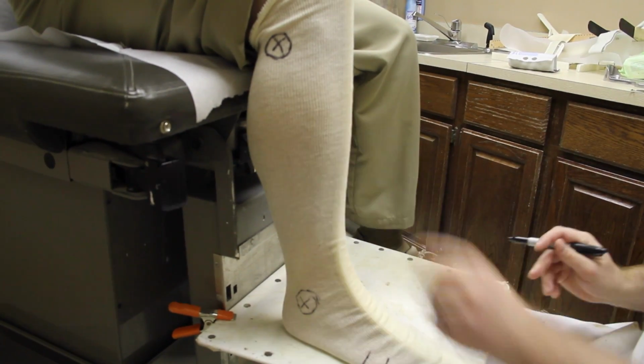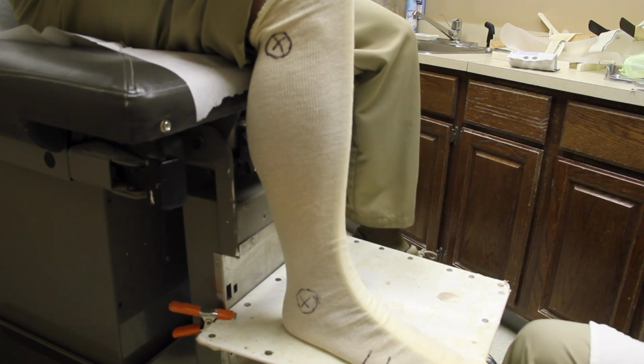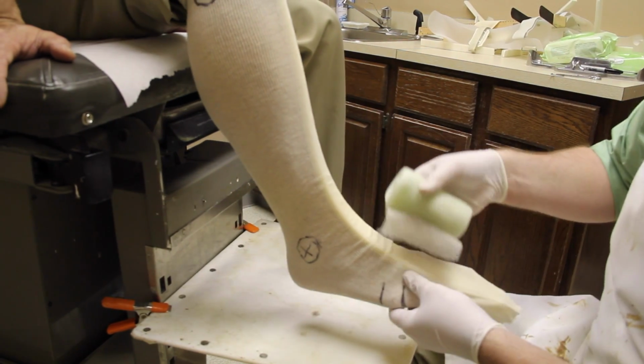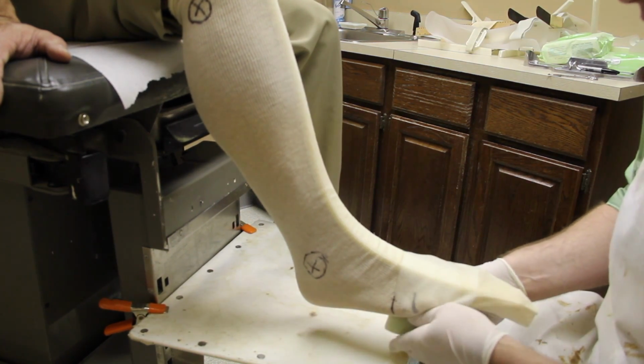When we fabricate the brace, we don't want to be at the neck. We want to be about an inch below the fibula head so that we don't impinge on any of the peroneal nerves. And then we start with the circumferential wrap. We usually start right at sulcus and work our way up.